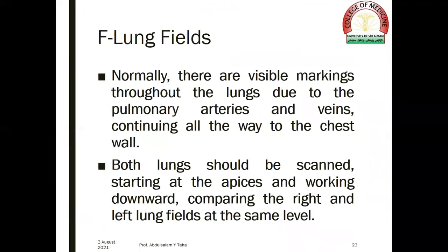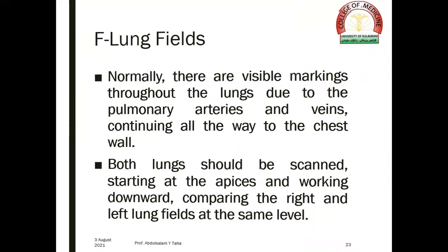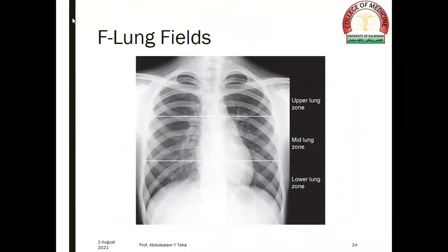Lung fields. Normally there are visible markings throughout the lungs due to the pulmonary arteries and veins continuing all the way to the chest wall. Both lungs should be scanned starting at the apices and working downward, comparing the right and left lung fields at the same level. The lung fields are divided into upper, middle, and lower zones. The upper zone is above an imaginary line at the level of the second costal cartilage, the middle zone between the second and fourth costal cartilage, and the lower zone below the fourth costal cartilage.